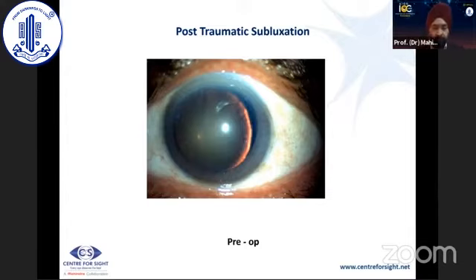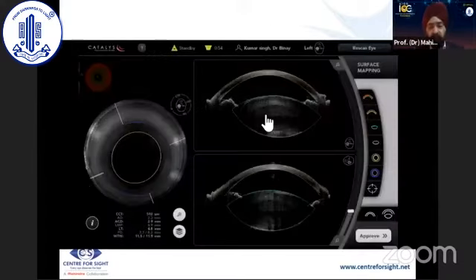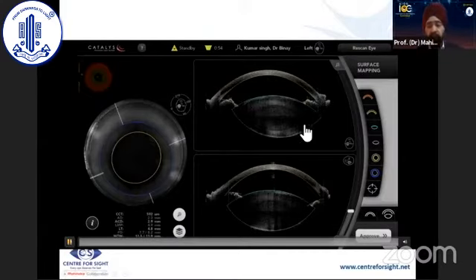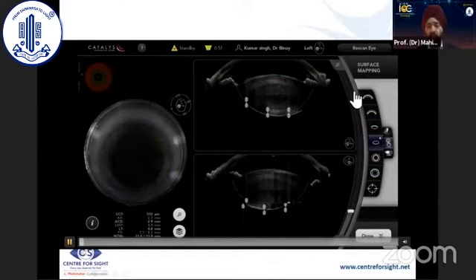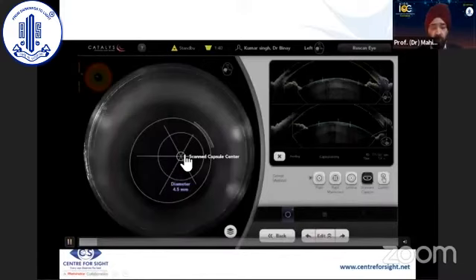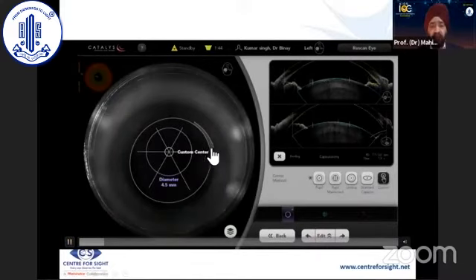Now, this is the case, as you can see. In this particular case, you can see the bowing backward of the iris. Can you see this iris? And it is going backward. So there is a subluxation, and if you look very minutely, there is vitreous coming onto the top. The machine will not give you the posterior and the anterior capsule on auto, so you have to bring it back. Now, this was on a scanned capsule, but we go on to a manual.